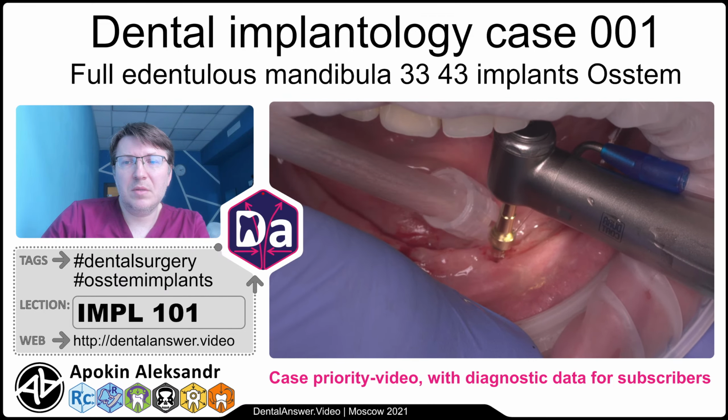During this work, I work in the 12 o'clock position. Machine insertion, the upper limit is 30 Newton centimeters.